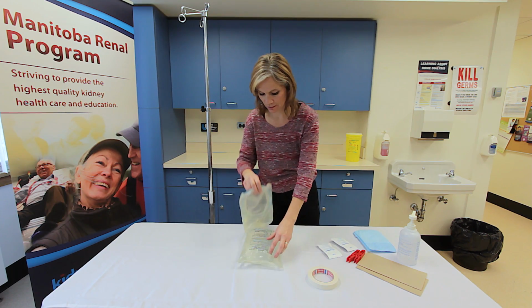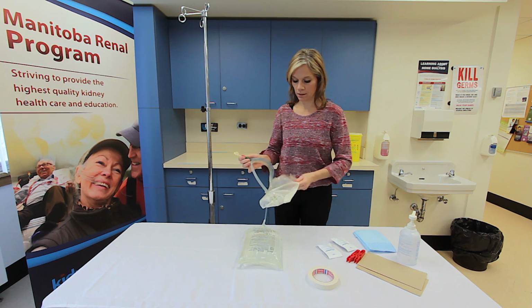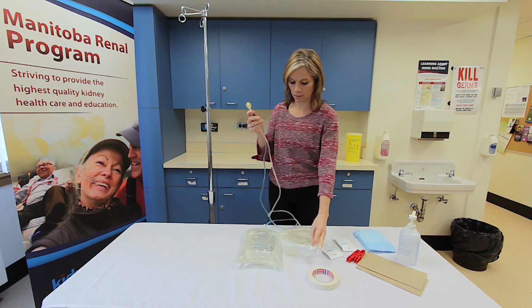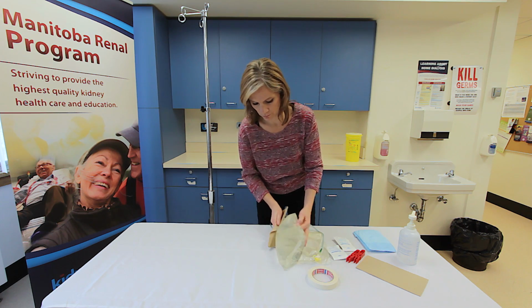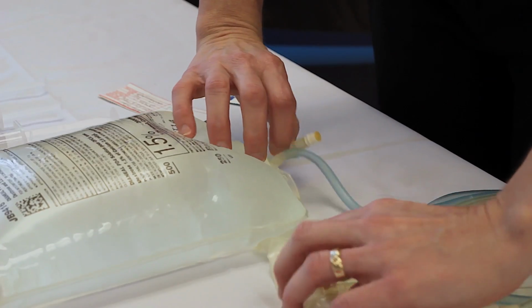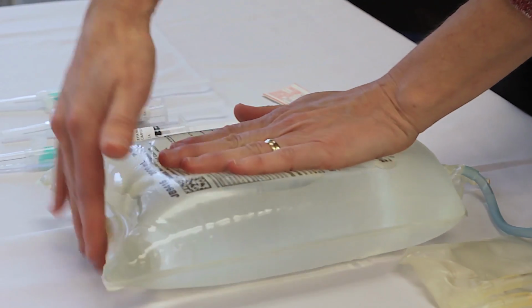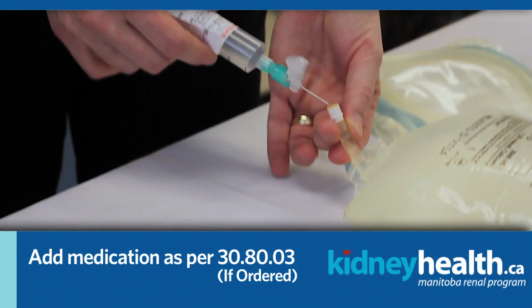Peel the drain bag and lines from the dialysate solution bag. Hold the patient connector so that it does not become contaminated. Using a clean paper towel, dry the dialysate solution bag. Check the dialysate solution bag for the clarity of the dialysate solution, intact medication port caps, and connector cover, and leaks by squeezing the bag. Add medication as per 3080-03 if ordered.